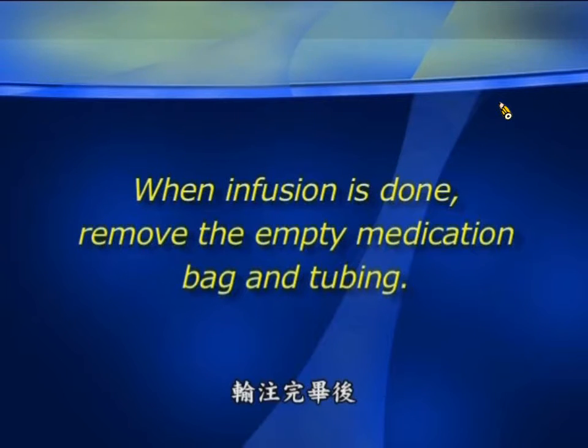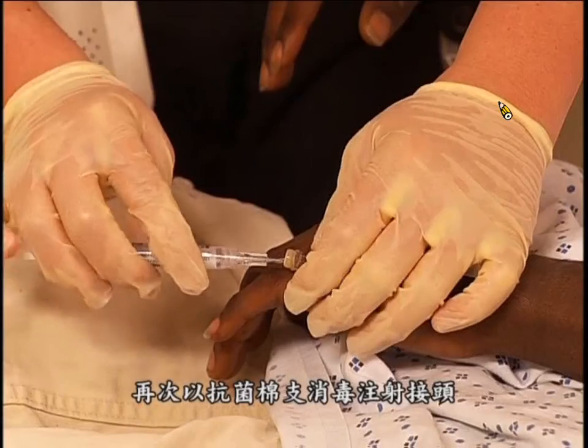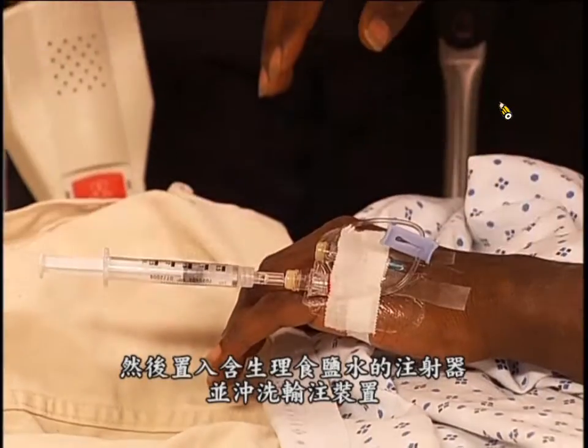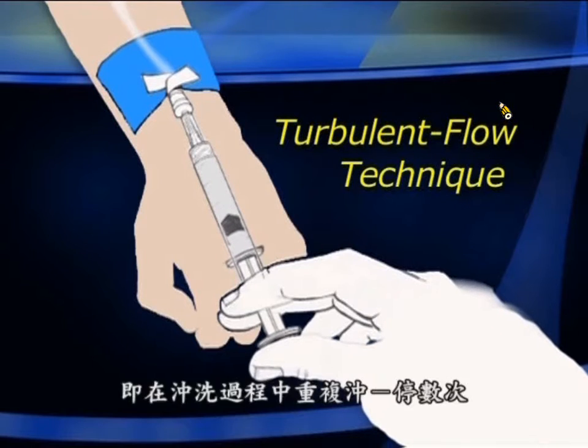When the infusion is done, remove the empty medication bag and tubing. After medication administration by either technique, use an antiseptic swab to clean the injection port again. Then insert a syringe of normal saline and flush the infusion device. To prevent blood clots, use the turbulent flow technique by flushing and stopping several times during the flush.